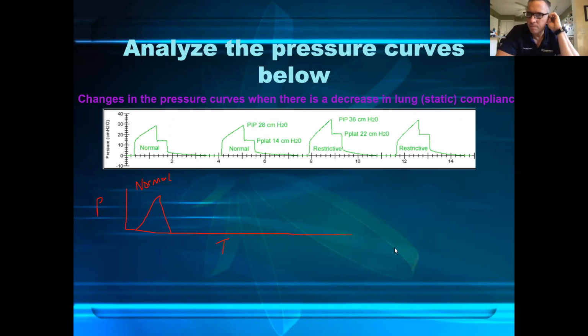I don't know if you're thinking of the V60 when patients are on BiPAP. I'm saying if they're not on any ventilator support. If they're not on any ventilator support, you won't see pressure building up. Inspiration is negative pressure. The only time you'll see positive pressure is if you're pushing air into their lungs. Oh, okay. Sorry.